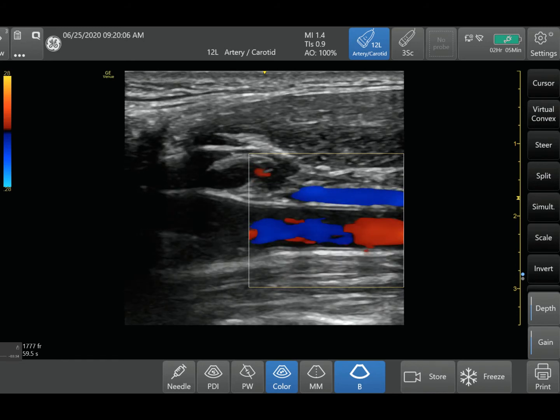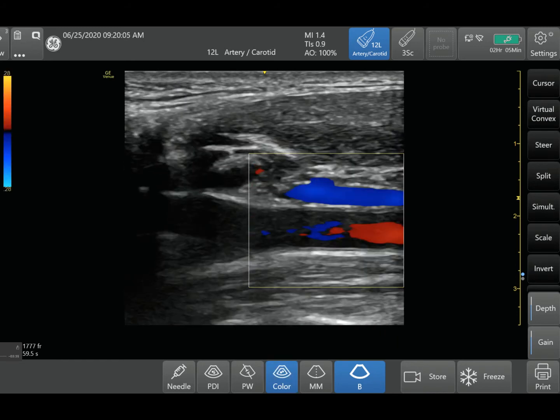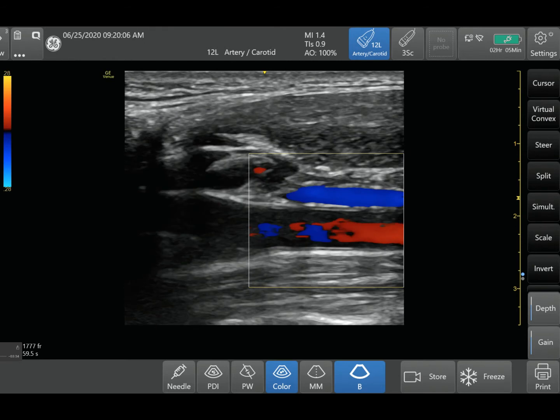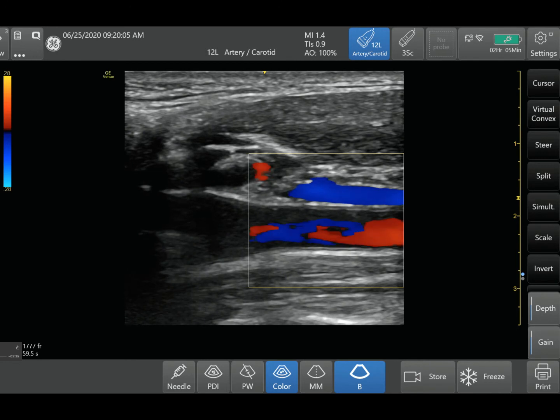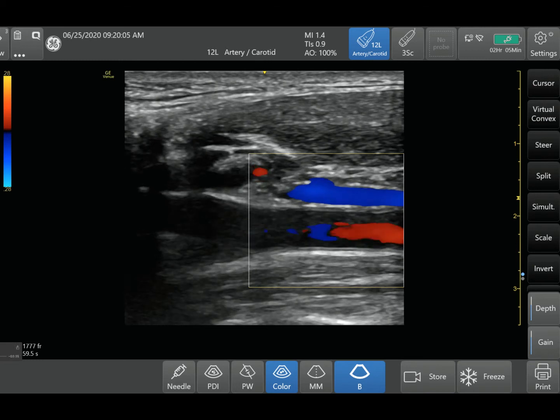You can see how the reds and blues are all jumbled in there because the signals aren't going either away from or towards the probe — it's going perpendicular. Sometimes you just can't get a good angle when you're on color Doppler.